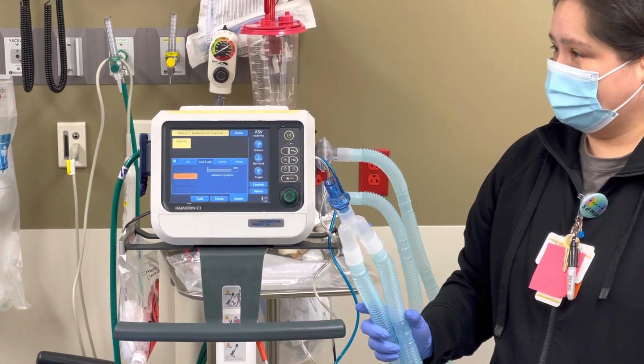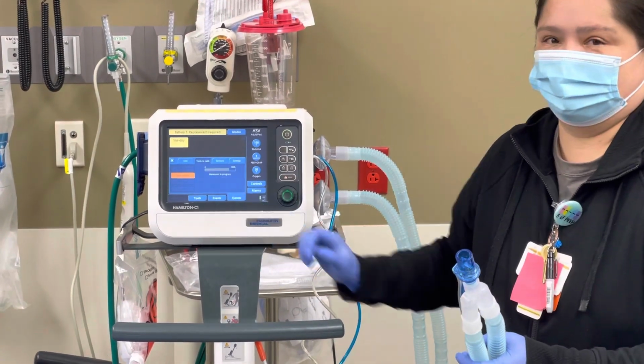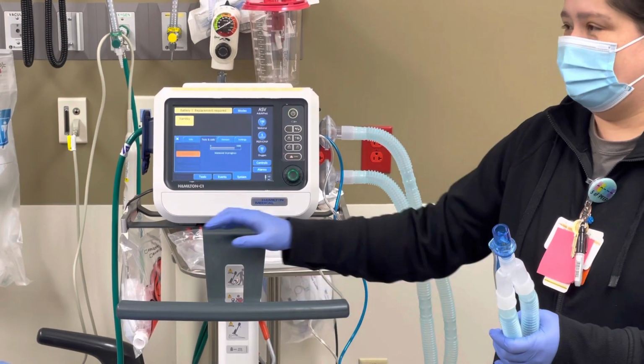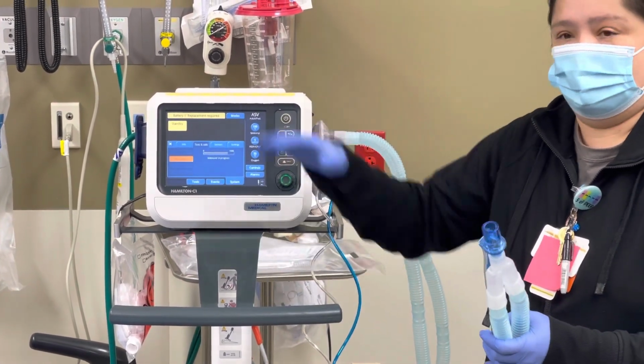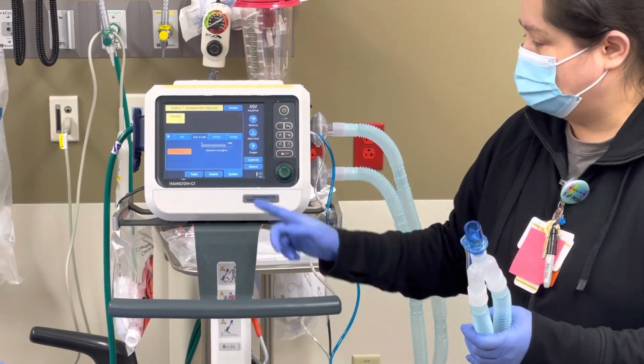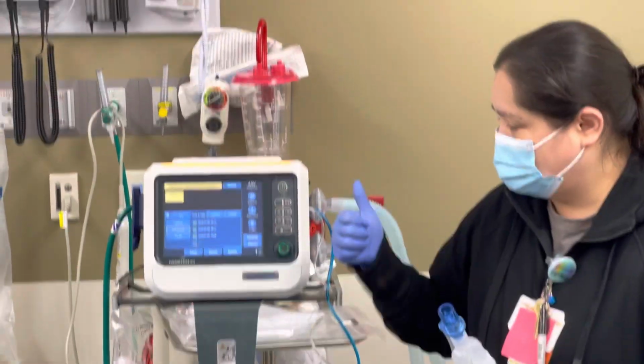How did you know when it was ready? Did it tell you to flip it back? It did. It said turn flow sensor. Okay. So if you miss it and you don't see it, it's gonna automatically say it failed. So just rerun it again and just make sure you pay attention, but it'll always ask you to flip it both ways. And so we have it checked, we're good.